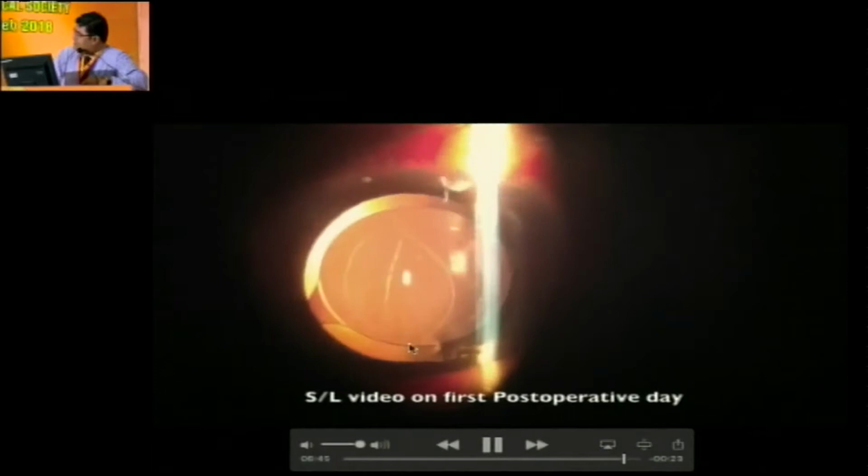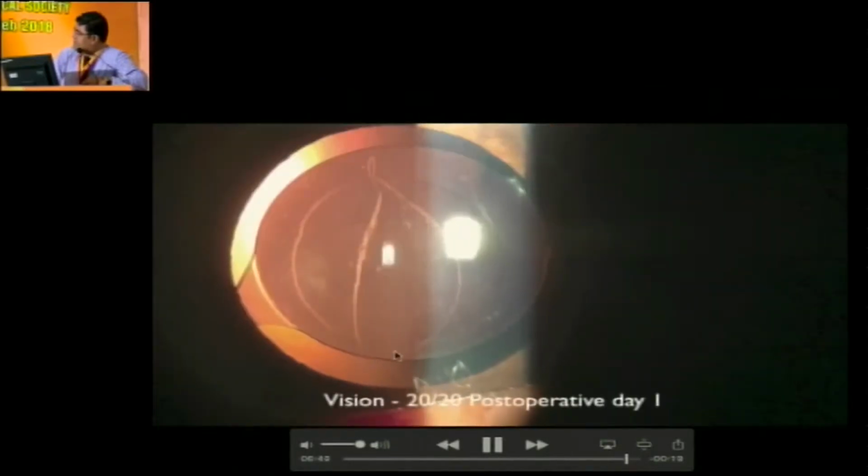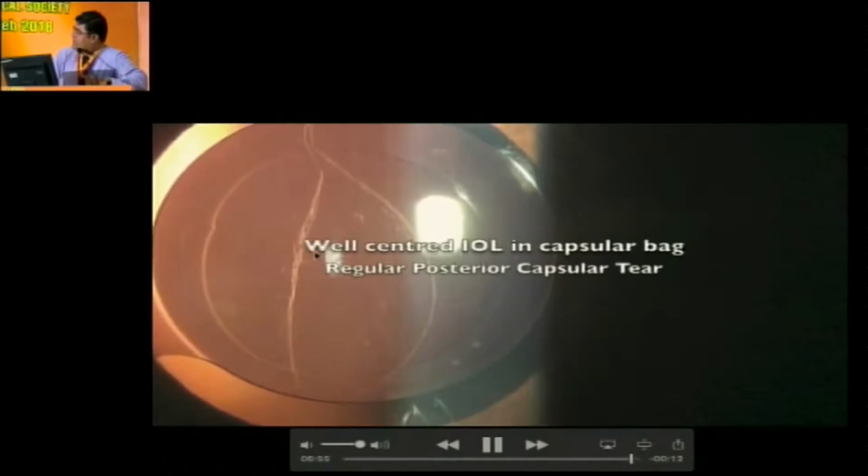So see, this is the slit lamp video on the first post-operative day. You can see that the IOL is nicely sitting in the capsular bag, and this is the posterior capsule tear which I converted into a nice posterior capsulorhexis.